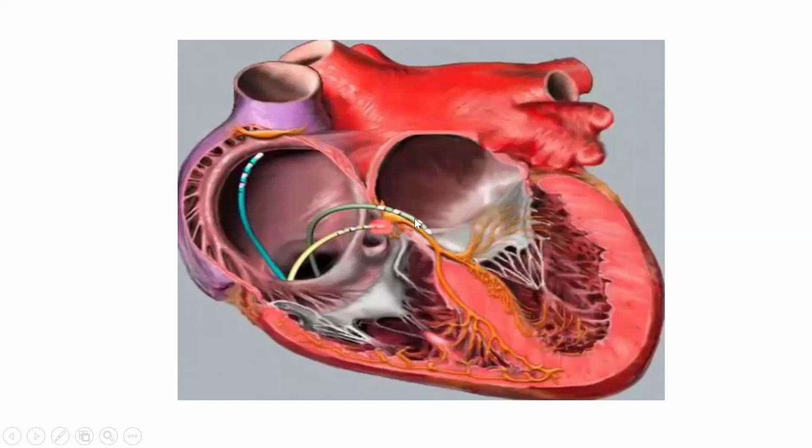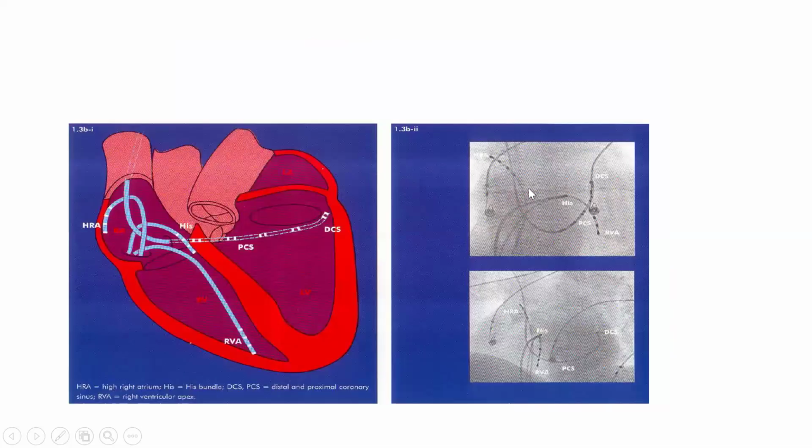So this CS catheter can be so long, sitting in the CS from here to here. Let me use this image to look at it. This is a CS catheter, these broken lines. You can see that the CS is in the atrioventricular groove posteriorly, and we said that the posterior chambers are the left atrium and the left ventricle. So you can see the way it is sitting between the left atrium and the left ventricle.